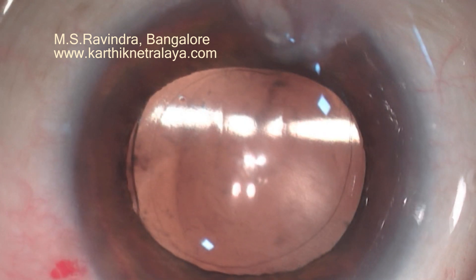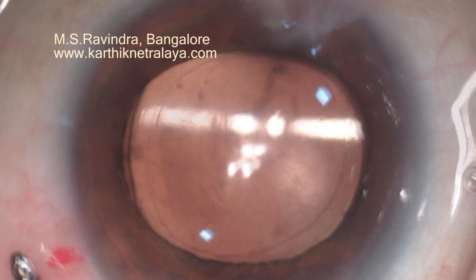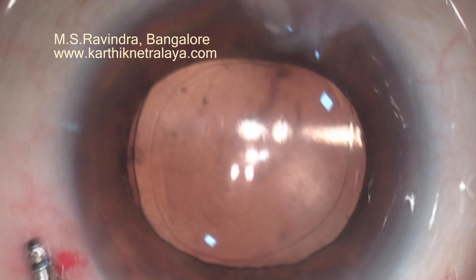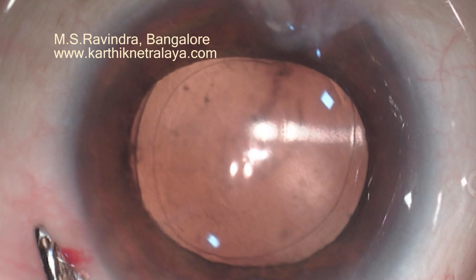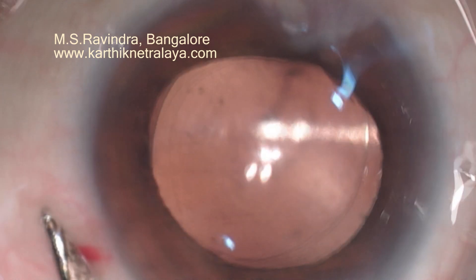You can see the fluid wave, which is obviously traveling from the zonular side across the patellar fossa to the other side, where it meets another fluid wave coming from the 10 o'clock position.